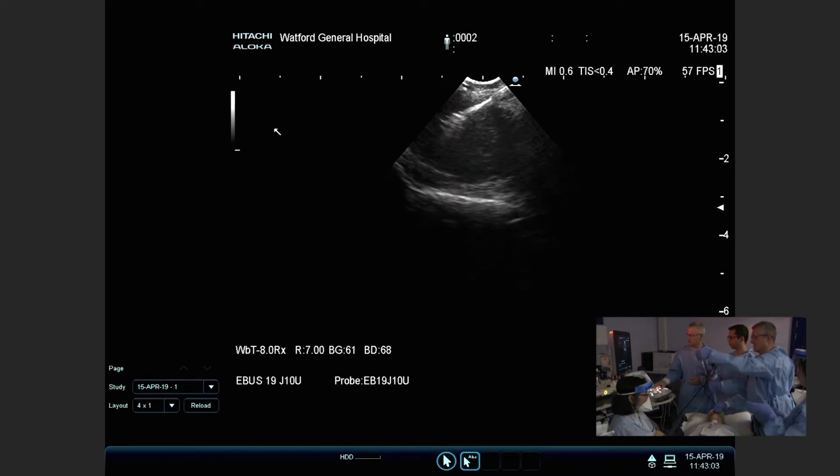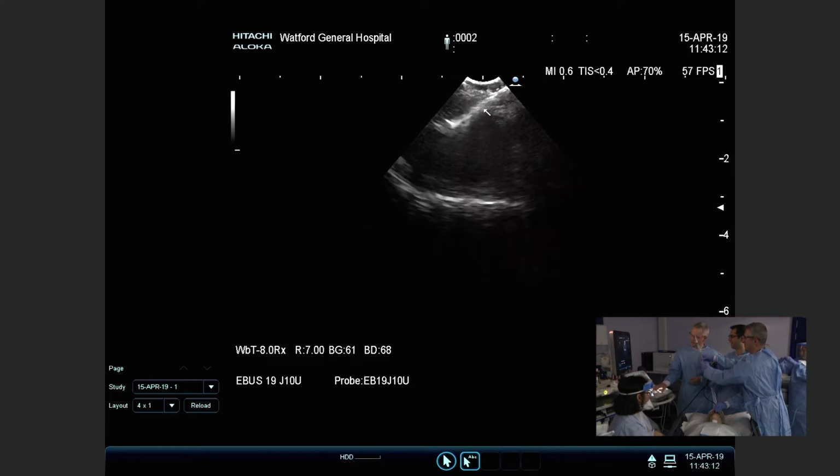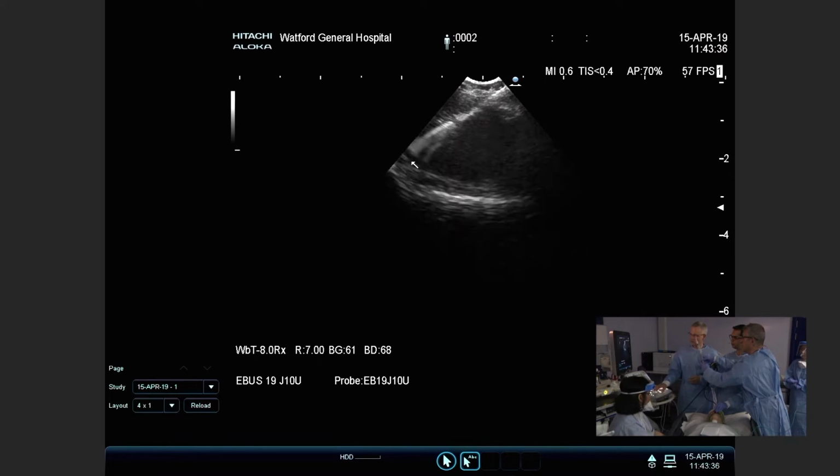So the stylet is coming out. The needle is about here. The tip, I think, is here. That's correct. And as the vacuum goes on, you can actually see the bubbles tracking up, which I think is a good sign that the vacuum is working. I think one benefit of being in the central part is that you get a longer throw from the proximal end all the way to the other side, the margin of the lymph node. But what we do know from the slide we've made is that it's quite a necrotic node.